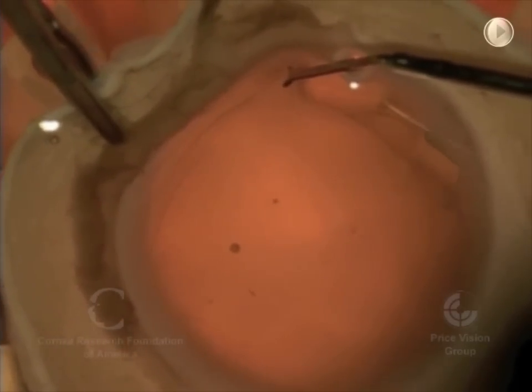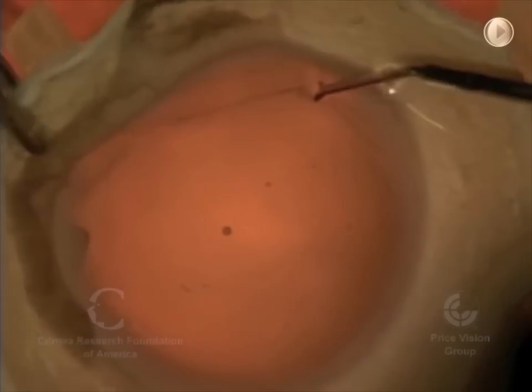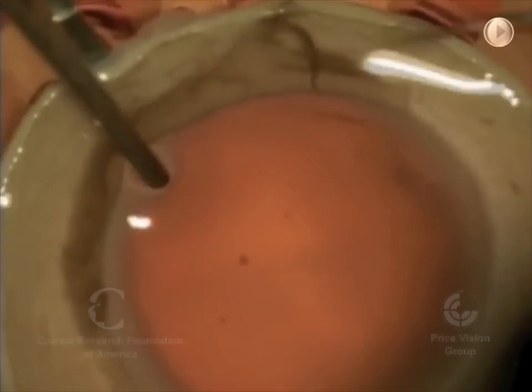This is a donor cornea, and what we have here is the clear cornea that's out in front. It covers the colored part of our eye and some of the white part of the eye, the sclera.